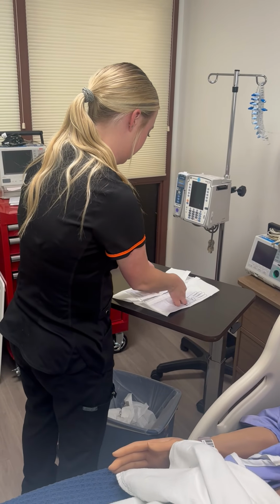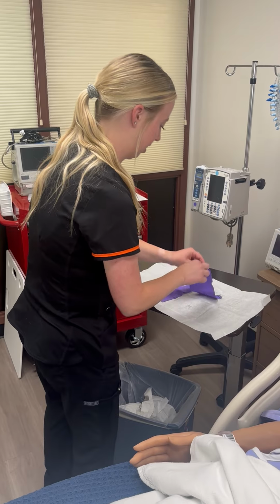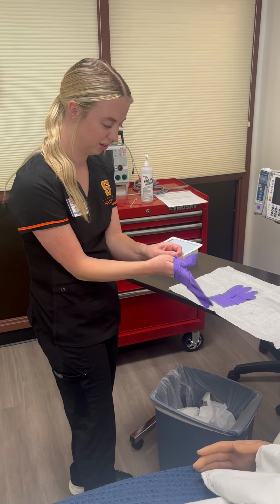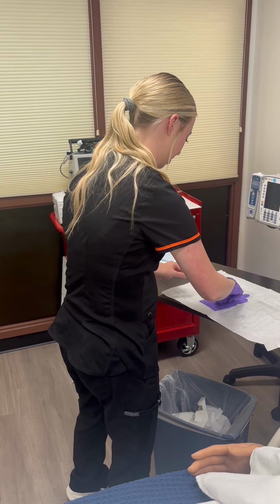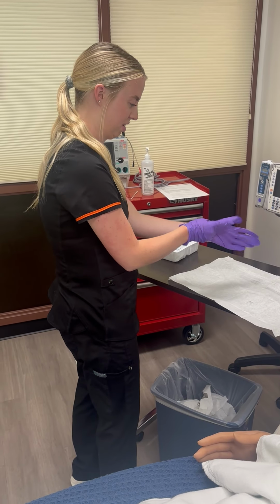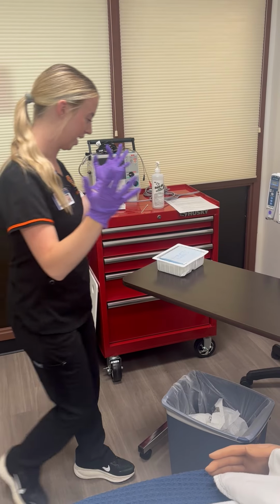Okay, let's open this correctly and put my gloves on accurately this time. Okay, now tuck under, and without ripping, I'm gonna slide my hand in there and get my glove on. Sterile this time. Move that out of my way. All right, here we go.